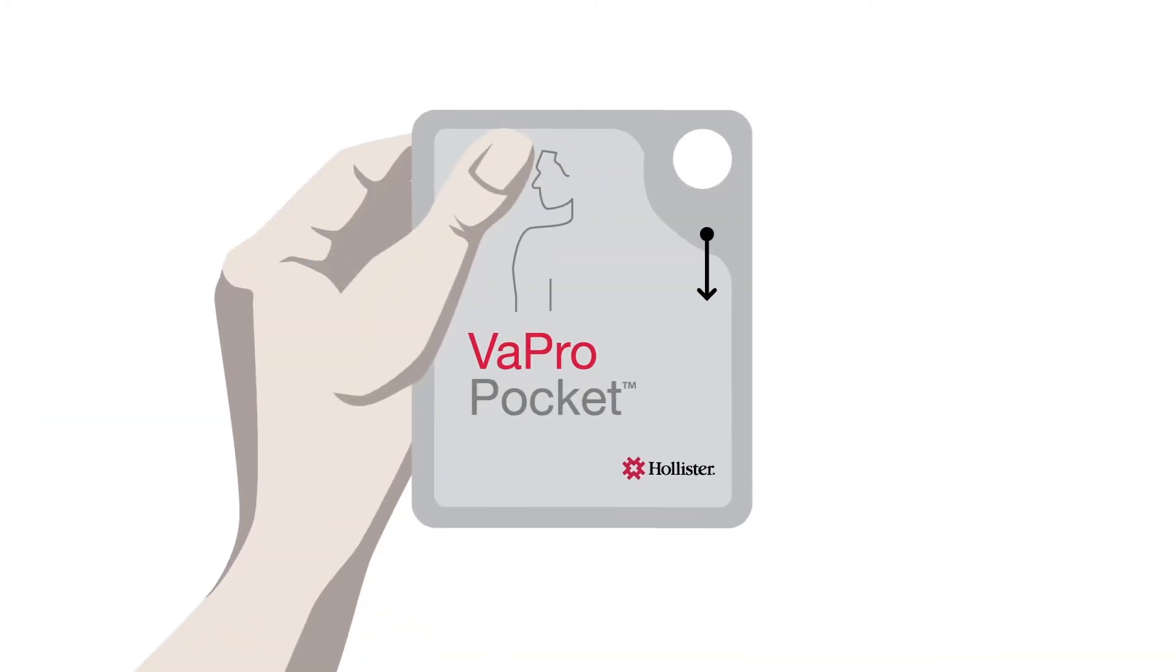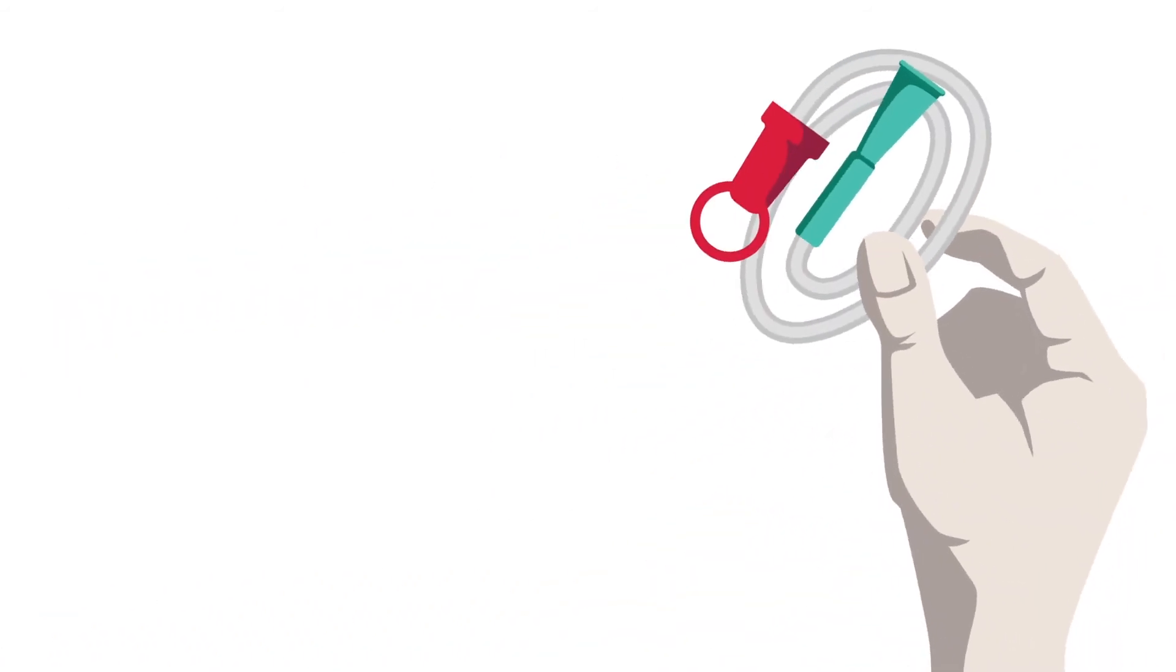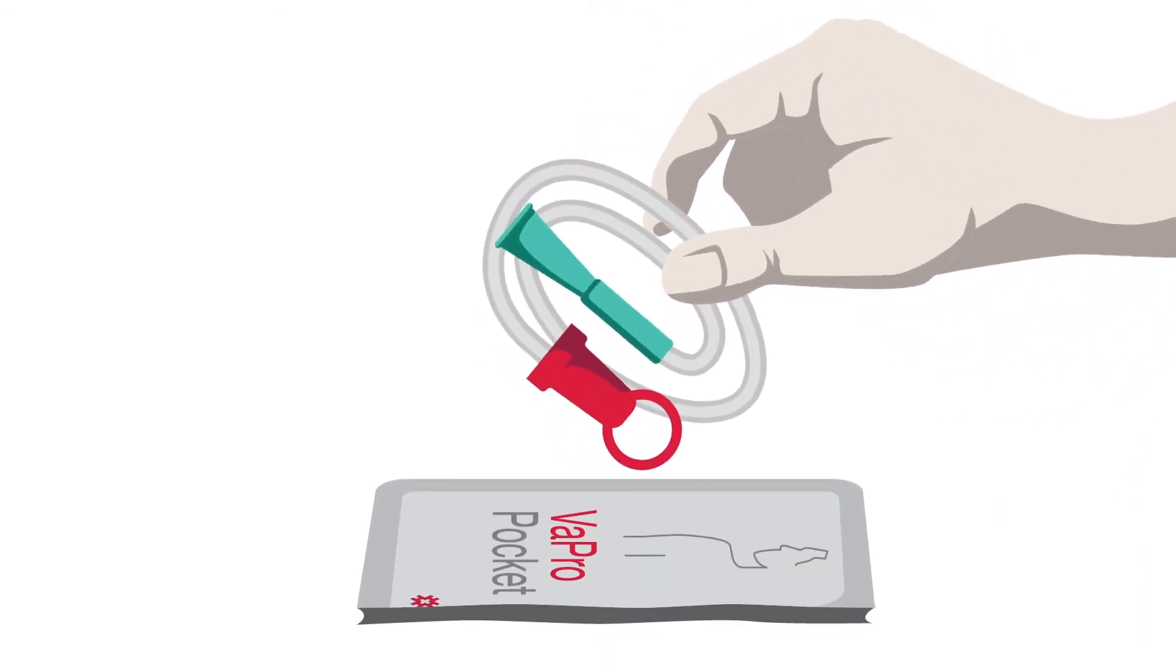After you have washed your hands, you can open the Vapro Pocket Catheter package. This can be done by inserting your thumb in the finger hole or placing your fingers at the top of the strip and tearing down the side of the package. Now the package is open, you can remove the catheter and place it on the open pack, which is left on a flat surface.